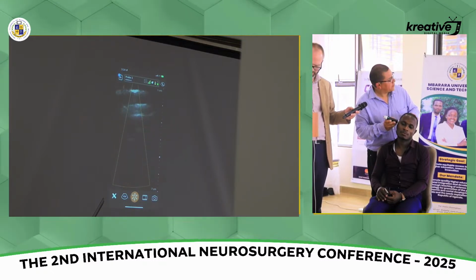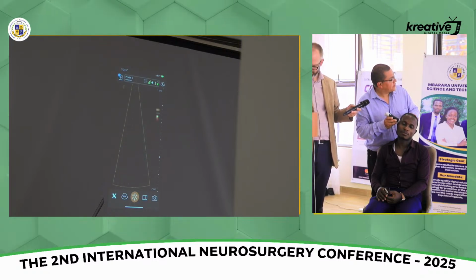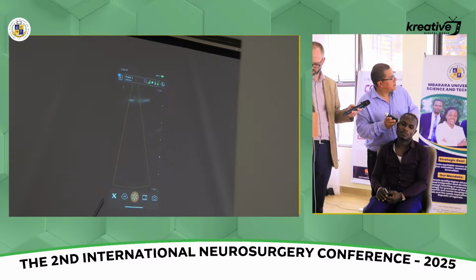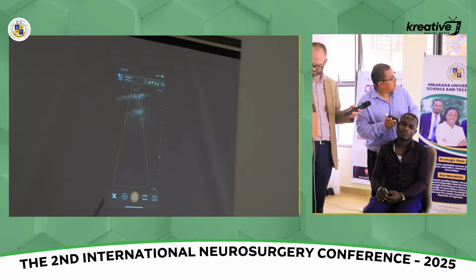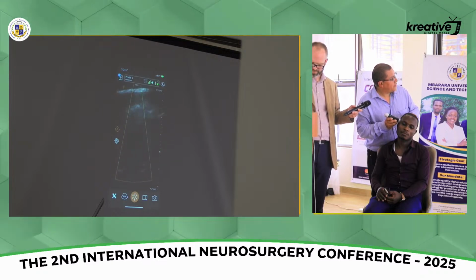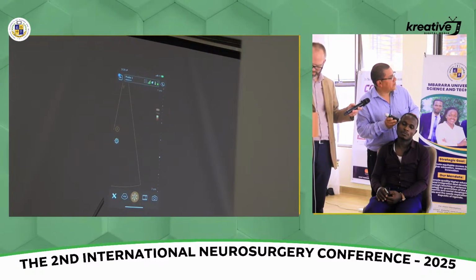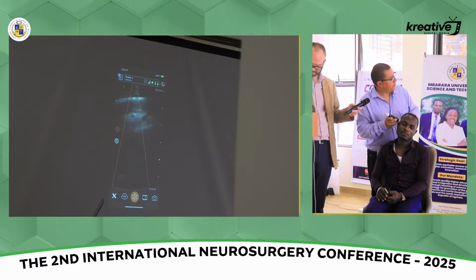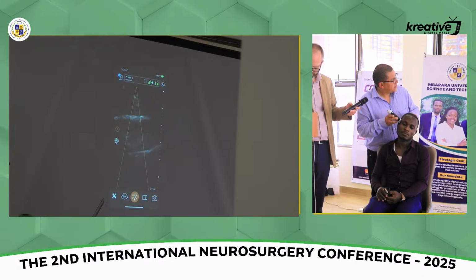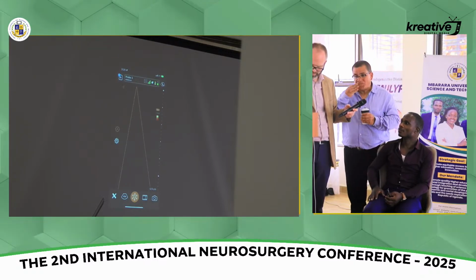Yeah, I'm not seeing it. Kind of a little bit more anterior, perhaps. I mean, it's penetrating for sure. But maybe if you decrease the gain distally. But we can always try the machine that you have at the hospital, which is maybe a little bit easier to handle. Yeah, well, that's the principle, anyways.